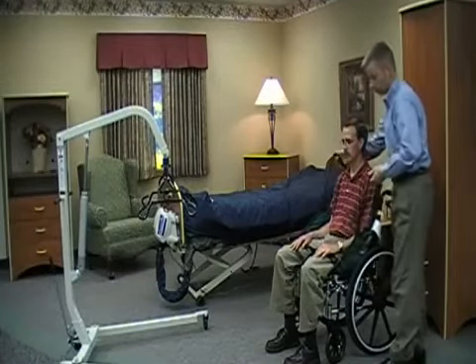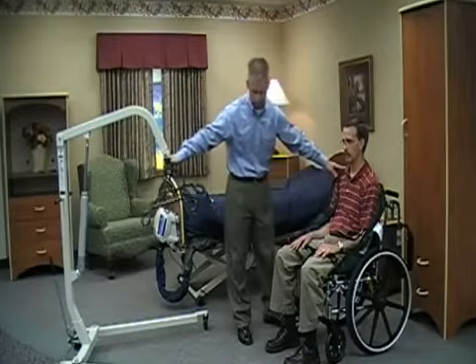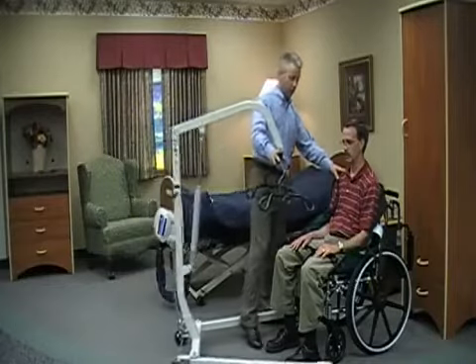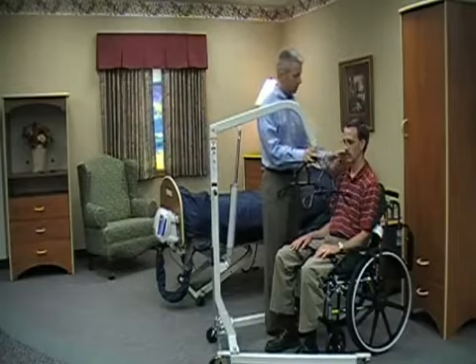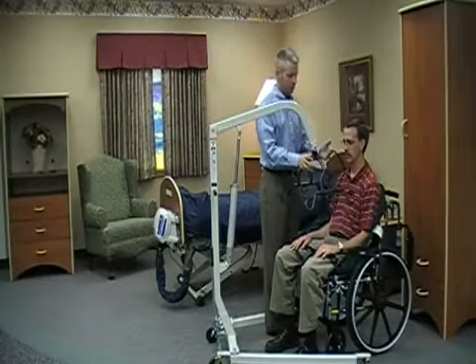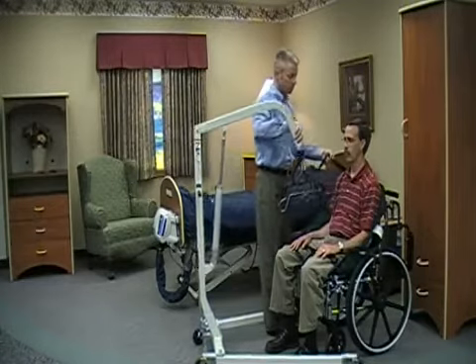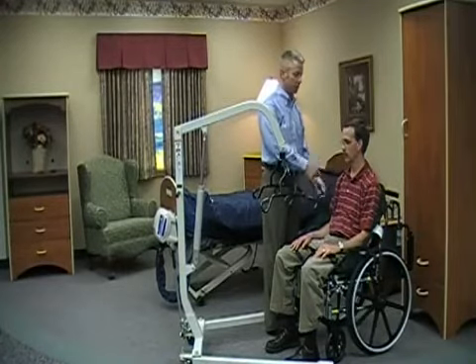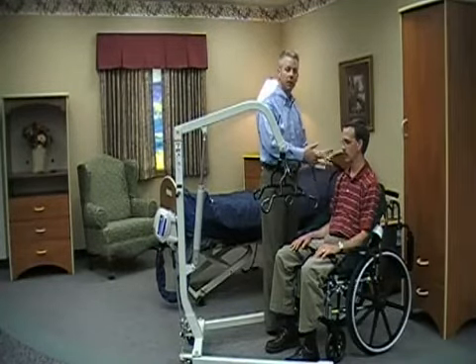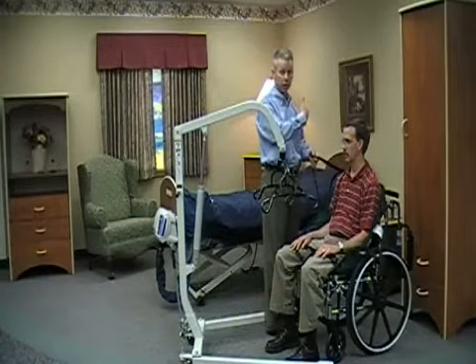I'm also going to make sure that both of my shoulder straps are accessible, and then I'm going to bring the lifter up to the resident. We want to ensure the cradle is at about chest height. Once we bring it up, we want to make connections with the shoulder straps first, and then with the leg straps. There are two different lengths of shoulder strap — if we use the shorter length, we'll have the resident in a better sitting position. If we use the longer strap, we'll have the resident in more of a reclined position. In this instance, if we were transferring from a chair to a bed, we'd want them reclined so we could line them up in the bed more appropriately.